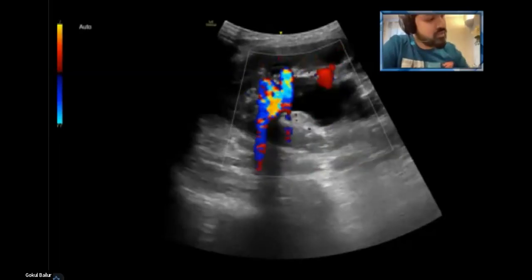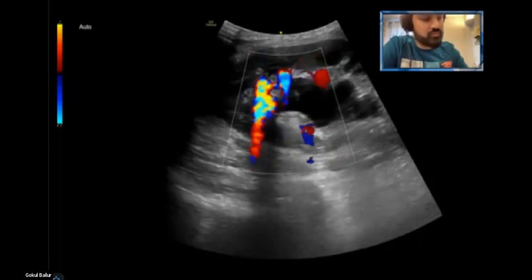You should be all over this. Yeah, I mean, that one looks diagnostic. It looks like you can see blood flow. Can I see the image again, please? Yeah, are you able to see the image? Yeah, there it is. Is that twinkle artifact on the upper pole?